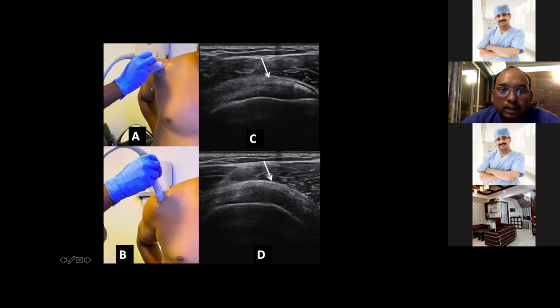Not to remember the name, but to see the position: you have to move the hand backwards, so that the palm lies on the hip as if you are keeping the palm inside your back pocket, and the 90-degree position of the elbow should still be maintained, and the elbow should be kept closer to the body. In this position, what happens?